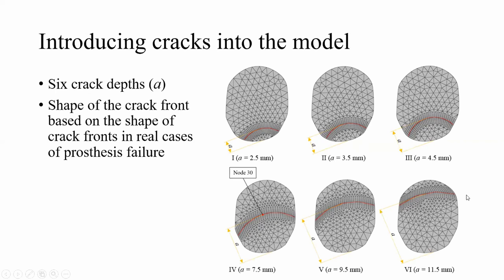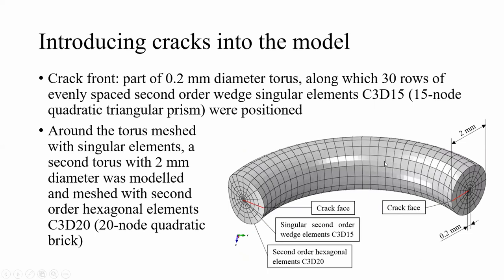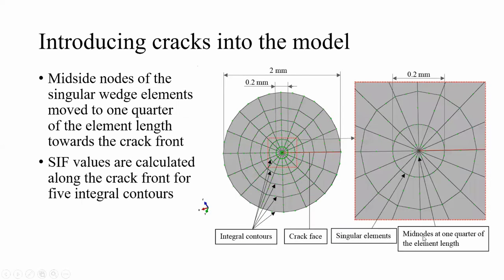Shape of the crack front is based on the shape of crack fronts in real cases of prosthesis failure. Here we see finite element mesh along the crack front. There are two parts. In part of 0.2 diameter torus along with 30 rows of evenly spaced second order wedge elements are positioned. Around the torus matched with singular elements, a second torus with 2 millimeters diameter was modeled and meshed with second order hexahedral elements. Mid nodes in singular elements were moved to 1/4 of the element length, providing singularity for these elements. Stress intensity factor values are calculated along the crack front for 5 integral contours.